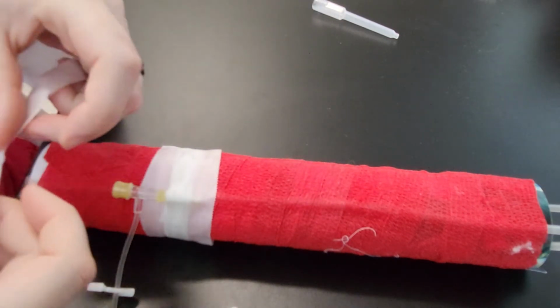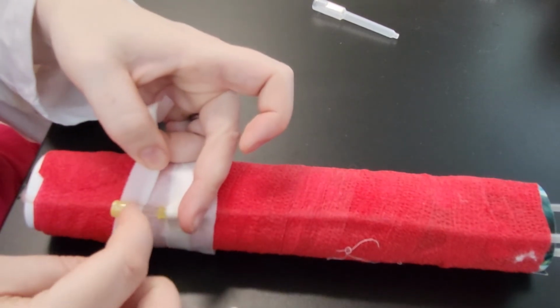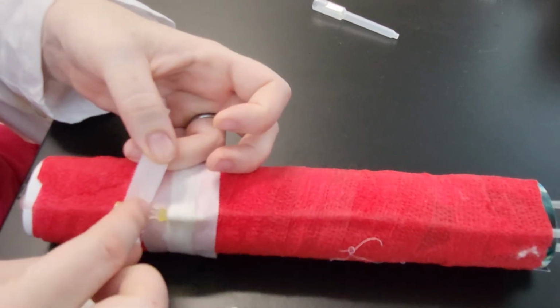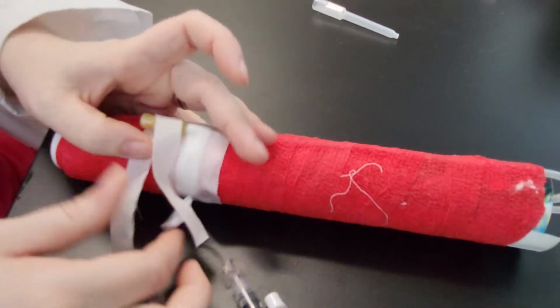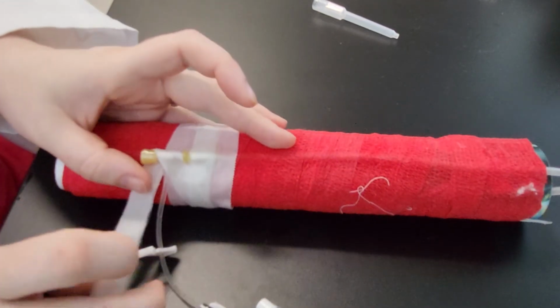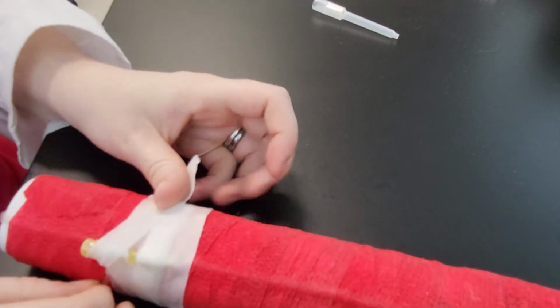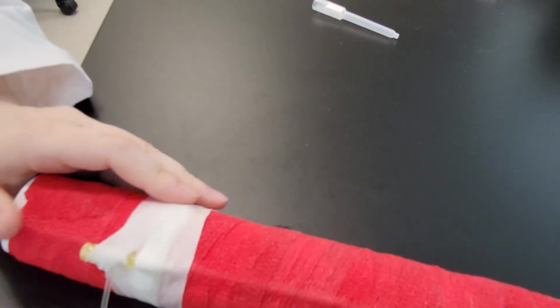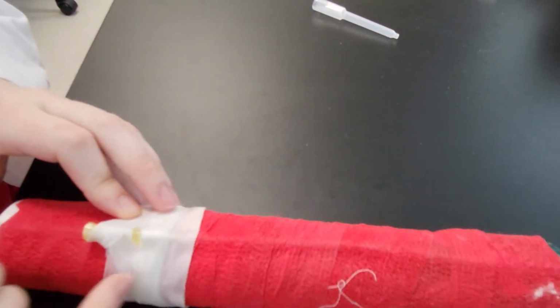So I am going to place sticky side up this portion around the injection hub. One side, I'm going to fold down the opposite direction, so that it looks like it has crisscrossed, and follow up with the same thing on the other side. So this anchors down the T-port so it is not easily able to come out of that catheter. So this is nice and situated now, and we will move on to our next piece of tape.